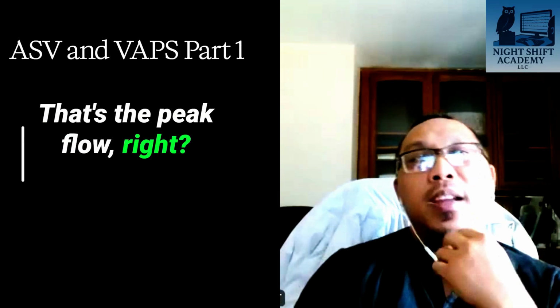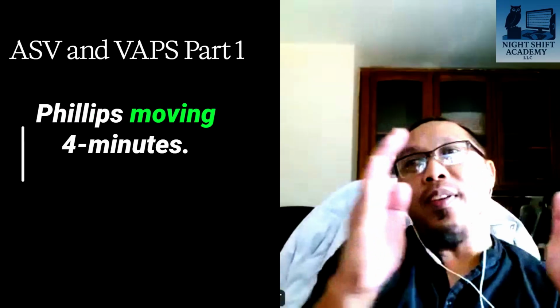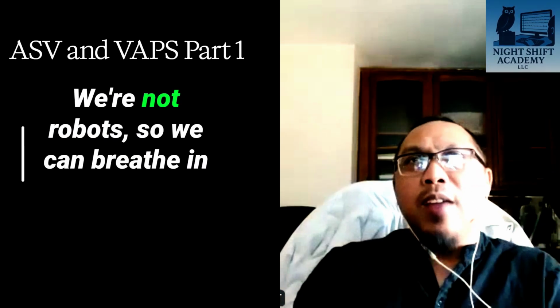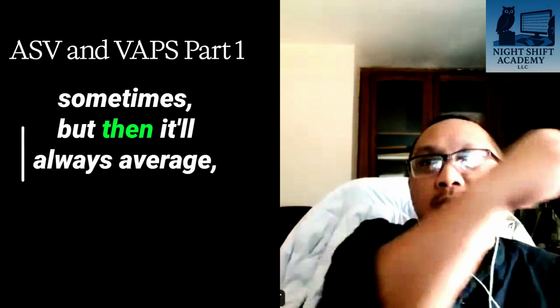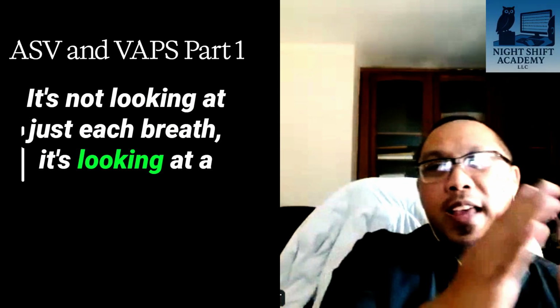That's the peak flow, right? But it looks at that on a 4-minute moving window. So ResMed moving 3 minutes, Philips moving 4 minutes. Both will allow some fluctuation. We're not robots, so we can breathe in and out deeper and a little bit shallower sometimes, but it will always average, right? It's not looking at just the breath, it's looking at a moving 3-minute or 4-minute window.